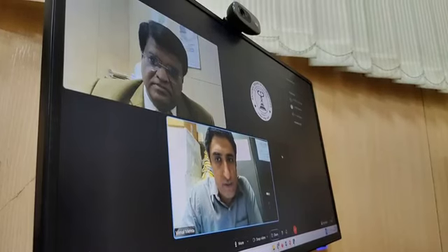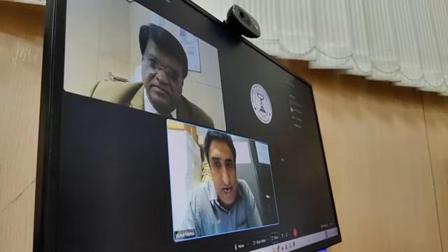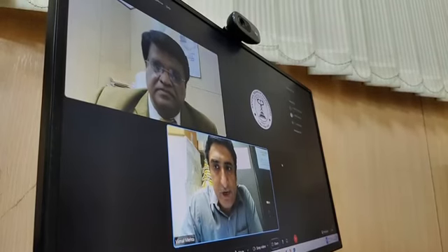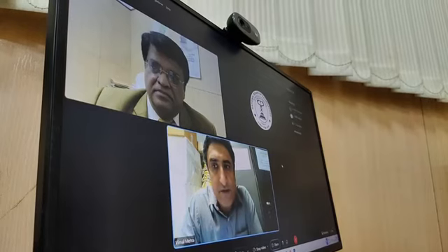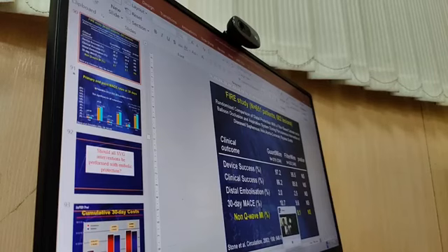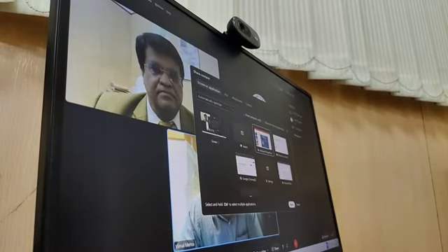So, I mean, a lot of thrombus was removed. There was some TIMI 1 flow, a trickle, but it was loaded with thrombus and all the chunks, cholesterol and everything. So, how do we approach such patients? Number one, that is one question. And then somebody is asking, how will a proximal protection device protect against distal embolization? We have heard about proximal protection in carotid angioplasty, the MOMA device and all, but how will it be effective in this kind of scenario?